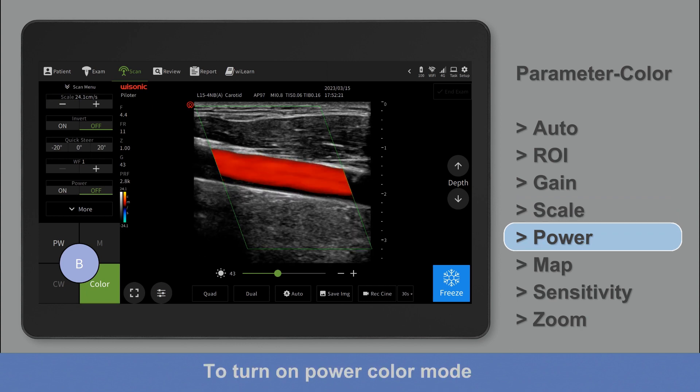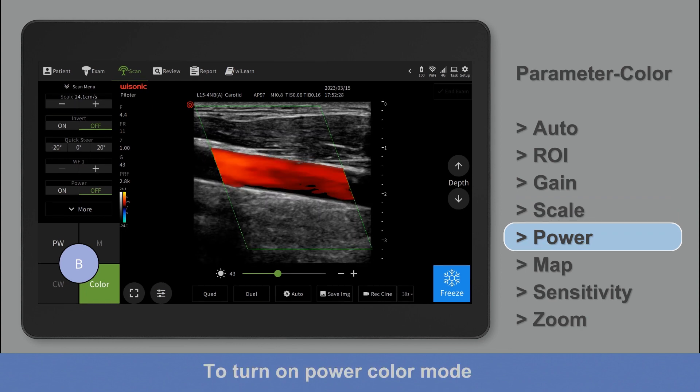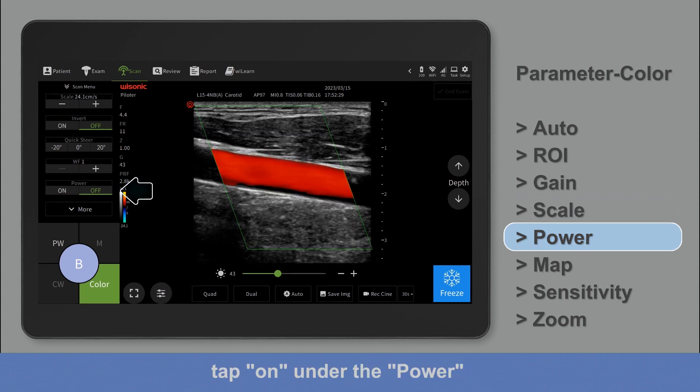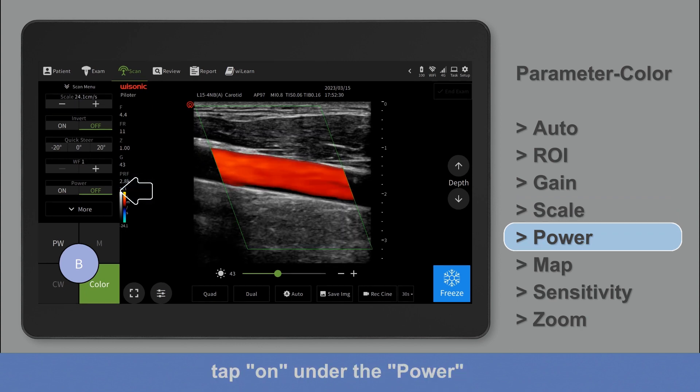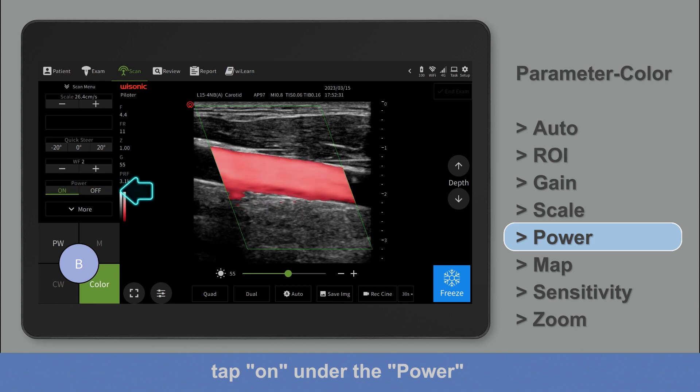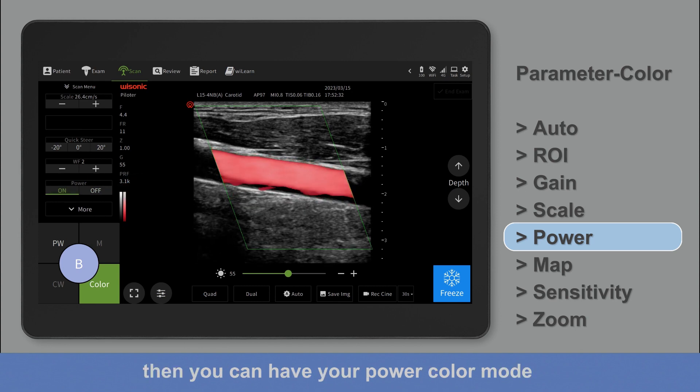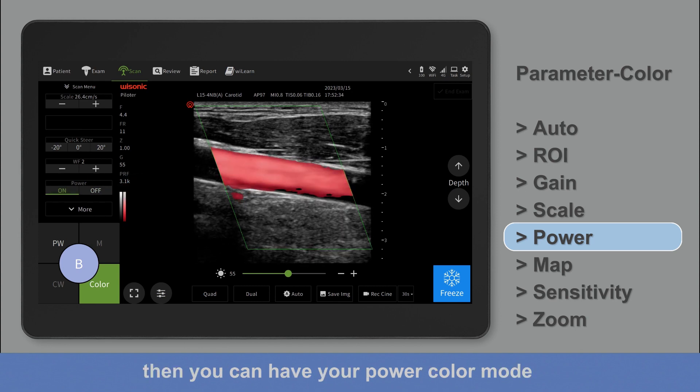To turn on power color mode, tap on under the power. Then you can have your power color mode.